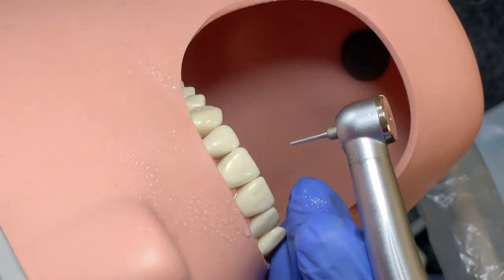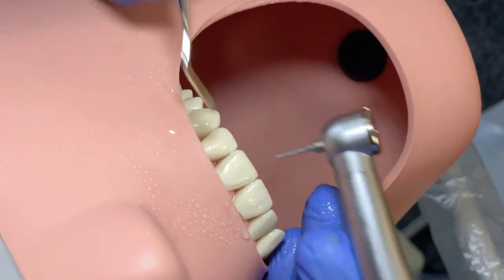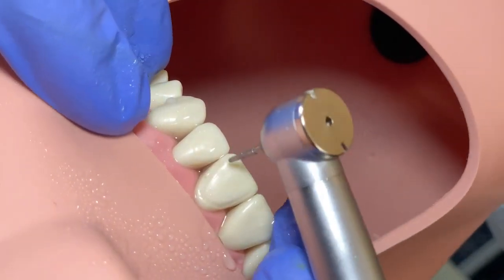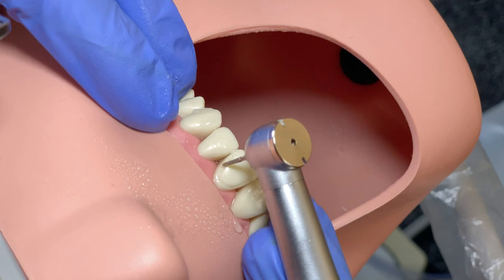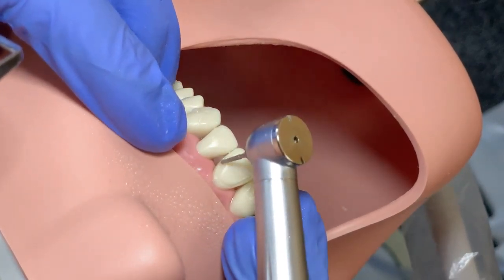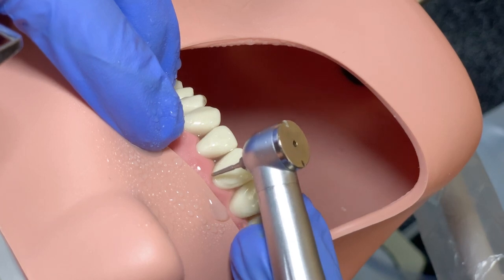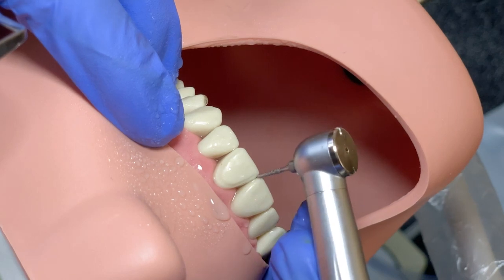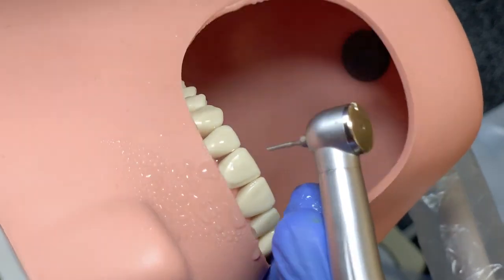Now, very important — can you see this? This side that's being cut here: can you see that your bur is cutting from the side as well? It is not enough that your bur is cutting from the tip. It is very important that the side of the bur is cutting from the buccal surface as well. Always remember that you need to keep 1 mm from the gingival line. This is almost my finishing line — this is the outline, the first step.